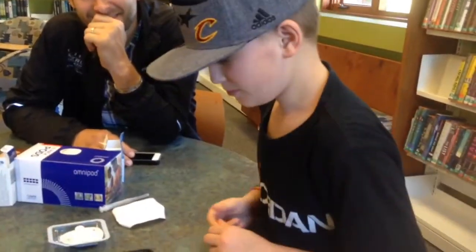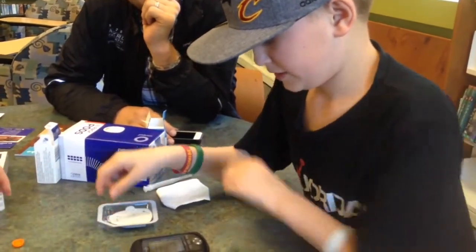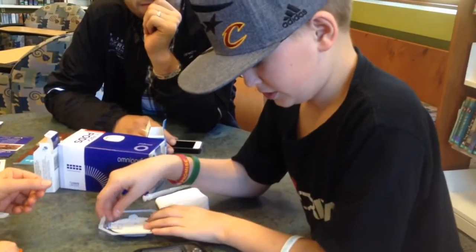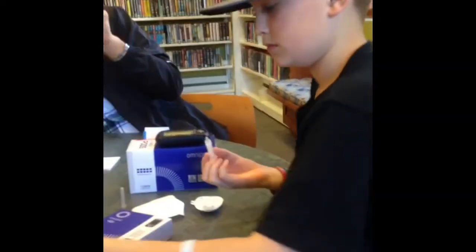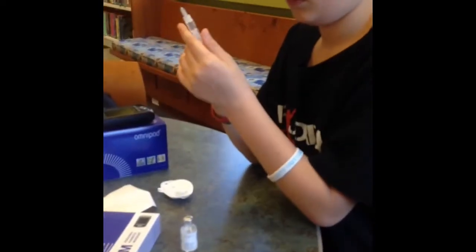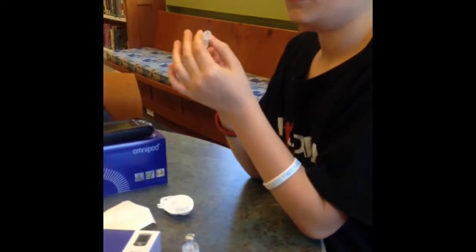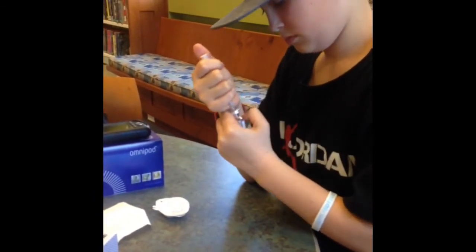We can put some on. Repair infusion site. Remove pod's needle cap. So I'm gonna show you — the way I do it is you pull the air on that little thing, and we're gonna pull it back to where it says the minimal amount. Good job. We're gonna go ahead and put it in your insulin bottle, straight in, so we don't break the needle.